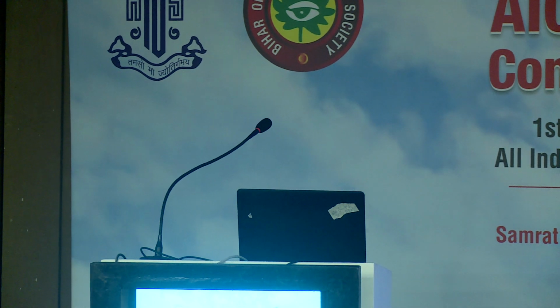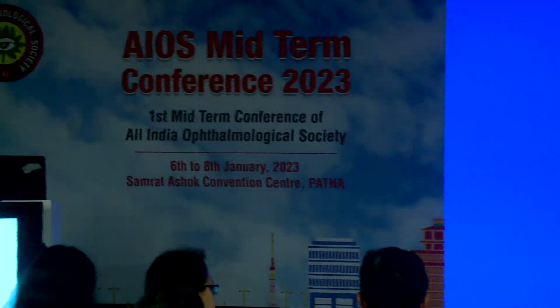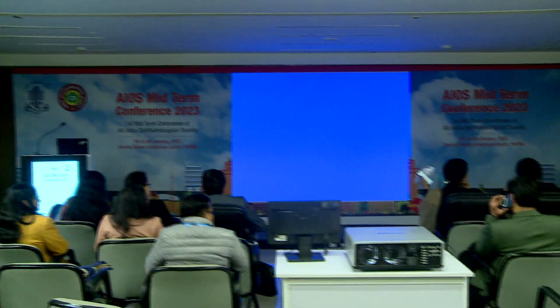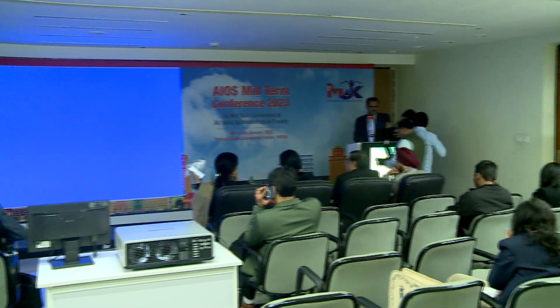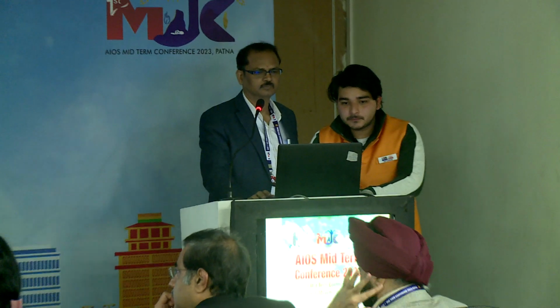Just before that, one question, I think I'll ask Sujata. Sujata, when there's an epithelial ingrowth, when do you decide that you will do a YAG, or when do you decide you will debride, and when do you decide on watching, of course, very stationary ones? I think any symptomatic epithelial ingrowth has to be dealt with. If it's a very small local nest where there is no connection to the exterior, then you can wait and watch.